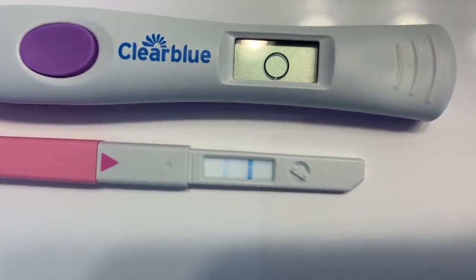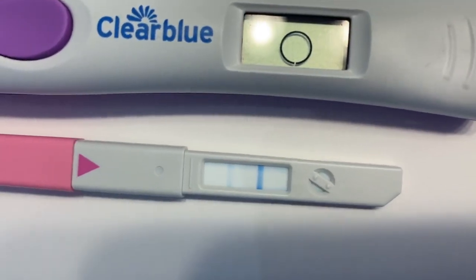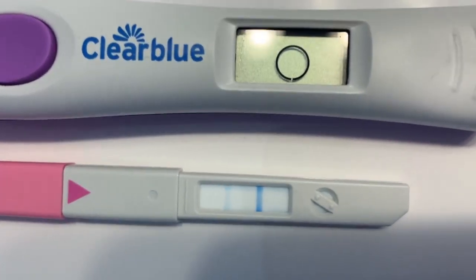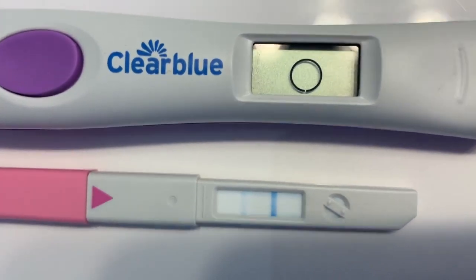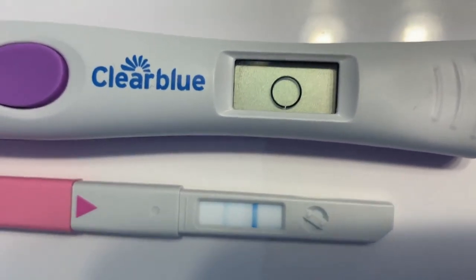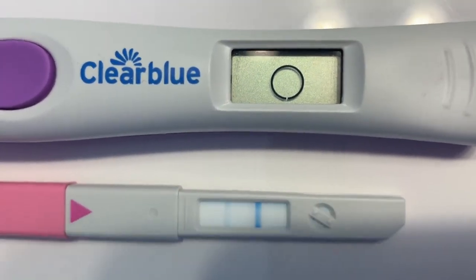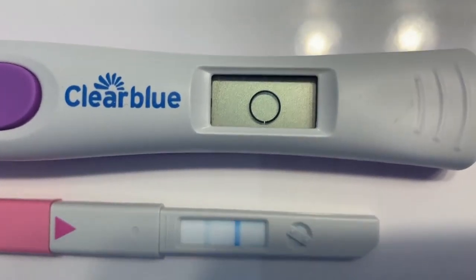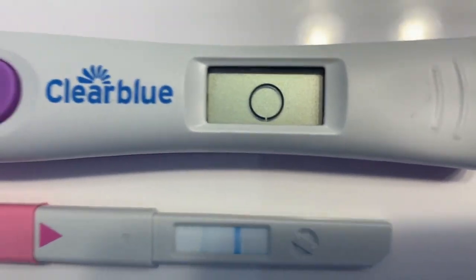If this would be anything like the ovulation I had when I got pregnant with my daughter, I should have a negative today. I didn't get my positive until a little after 1 o'clock on cycle day 12. So if I just skip the flashing smiley face altogether and go straight to a surge tomorrow at 1, that would be exciting. We'll see what happens. If I feel a bunch of activity tonight in my ovaries, I will maybe test at 8 o'clock or 7:30 tonight. I usually shower around 7:30. So I might just do one to see if I would start flashing tonight.